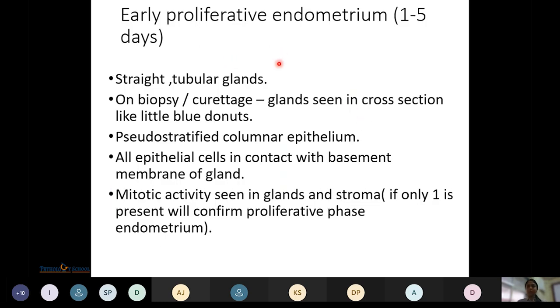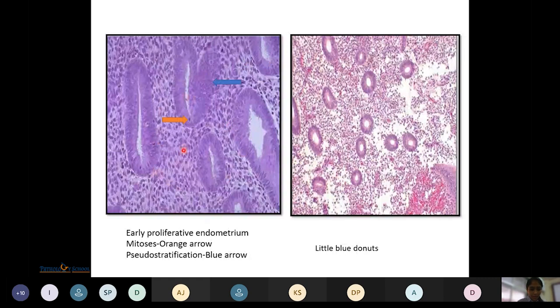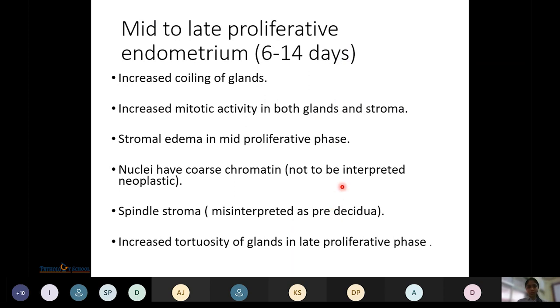Early proliferative endometrium (days 1-5): glands are straight and tubular; in cross-section they appear as little blue donuts. The epithelium is pseudo-stratified columnar, with all epithelial cells in contact with the basement membrane of the gland. Mitotic activity is seen in both glands and stroma; if only one is present it still confirms the proliferative phase. Microscopically, mitosis (orange arrow) and pseudo-stratification (blue arrow) are evident, along with the little blue donuts on cross-section.